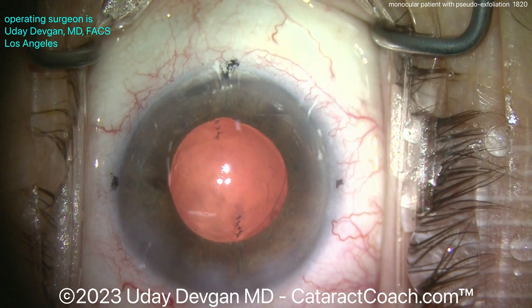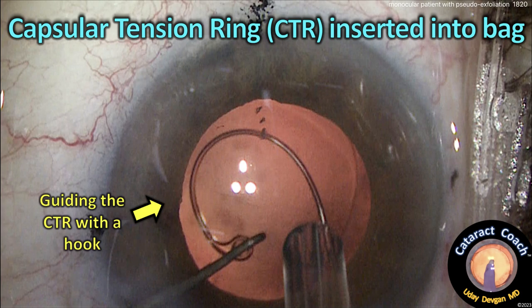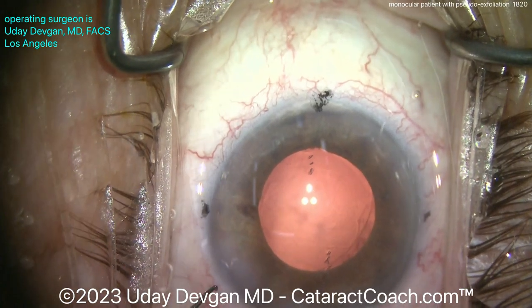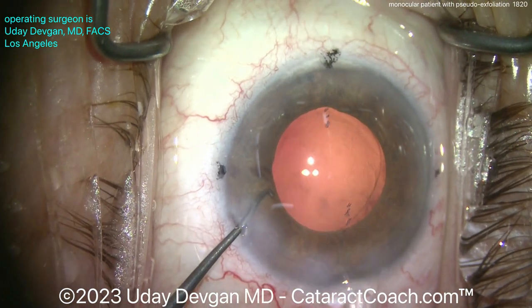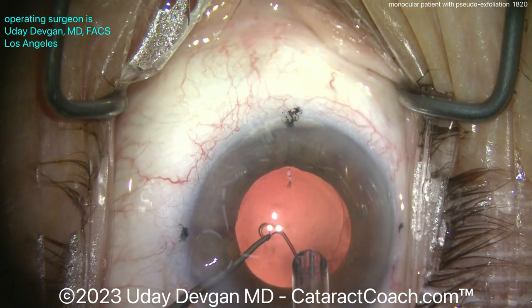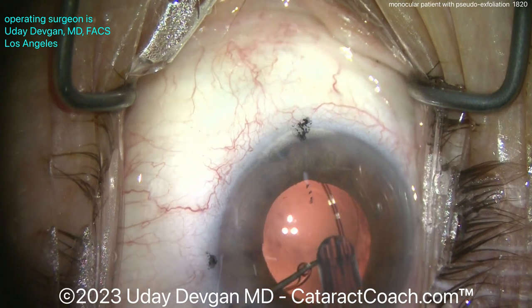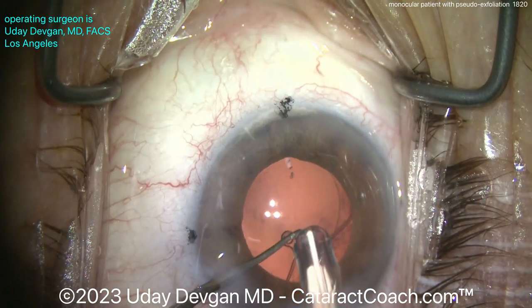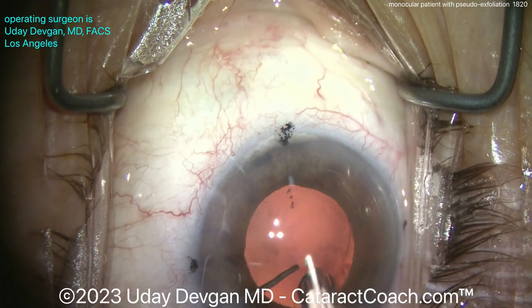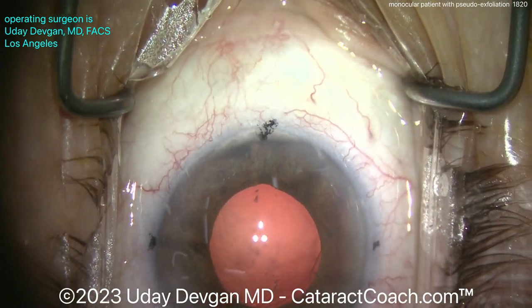We need to put a capsular tension ring in this eye — it will give good support for our toric lens and keep the capsular bag open. We'll use a Sinskey hook to guide the CTR into the capsular bag. Here's the CTR and here comes the Sinskey hook in the other hand. We get the Sinskey hook inside the eyelet of the leading part of the CTR, then dial it into the eye. Using the injector to release the trailing end — there it is — and that same tip pushes the eyelet off the hook. The capsular ring is beautifully placed in an atraumatic way.